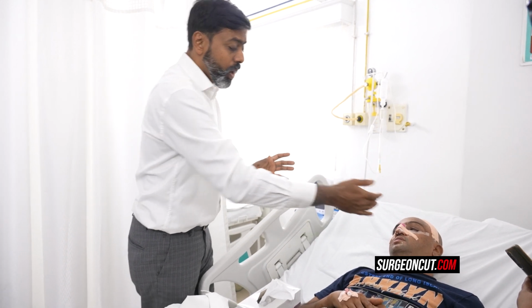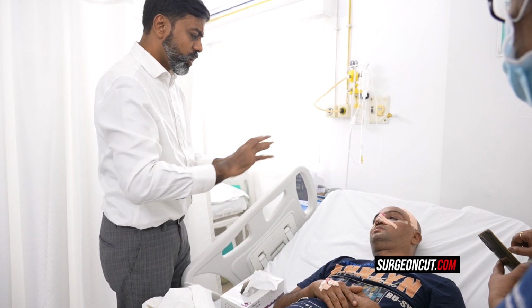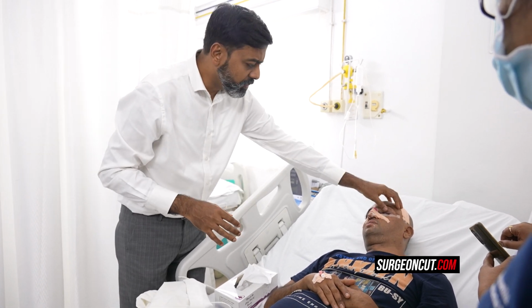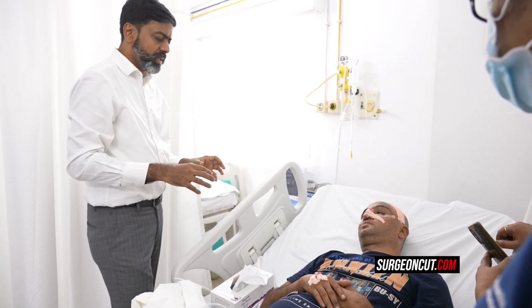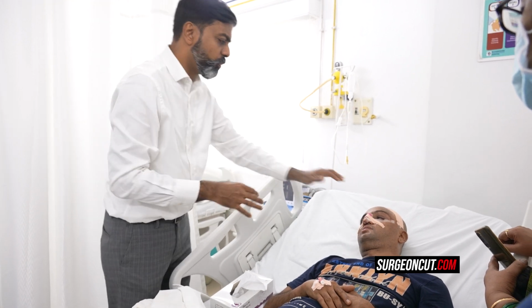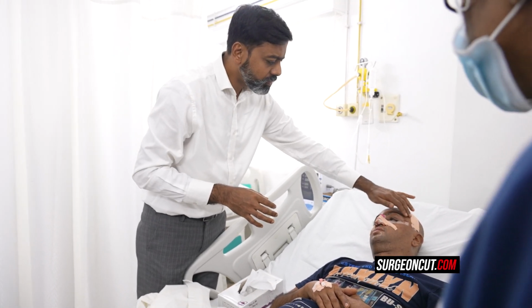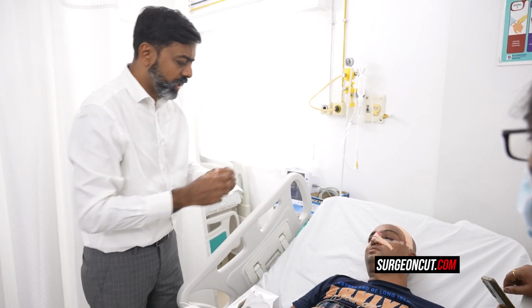So the third part, because this eye was totally smashed, I've done some onlay and everything, so it's going to be significantly better. Now it's all edema, okay? But you see already the eye has really moved up and it's tight, and with time that will all come down and there'll be good improvement. You can see something is a little loose, all will heal up and shrink.